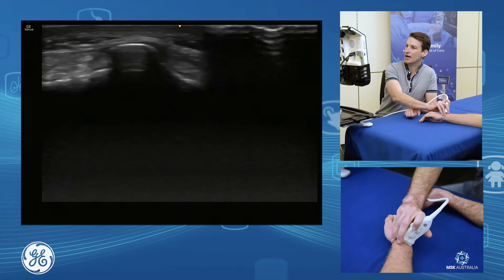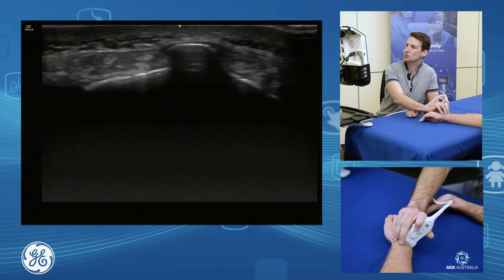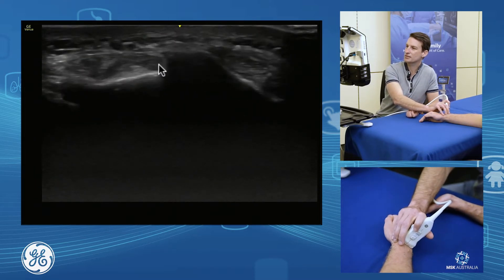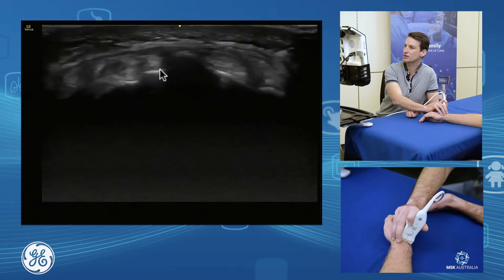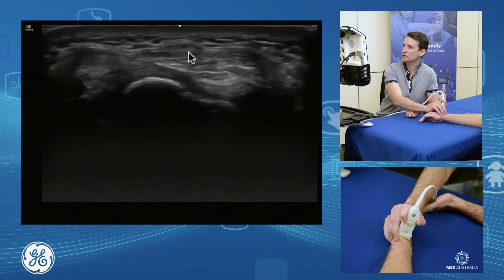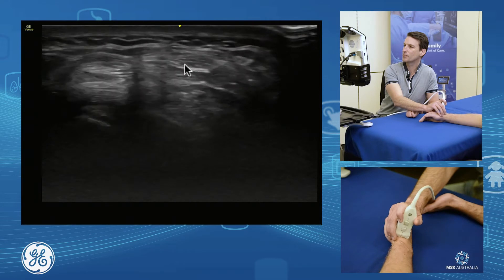As we move over to the other side of our Lister's tubercle, we come onto our extensor pollicis longus, which runs down over the top of our compartment two tendons towards the thumb.